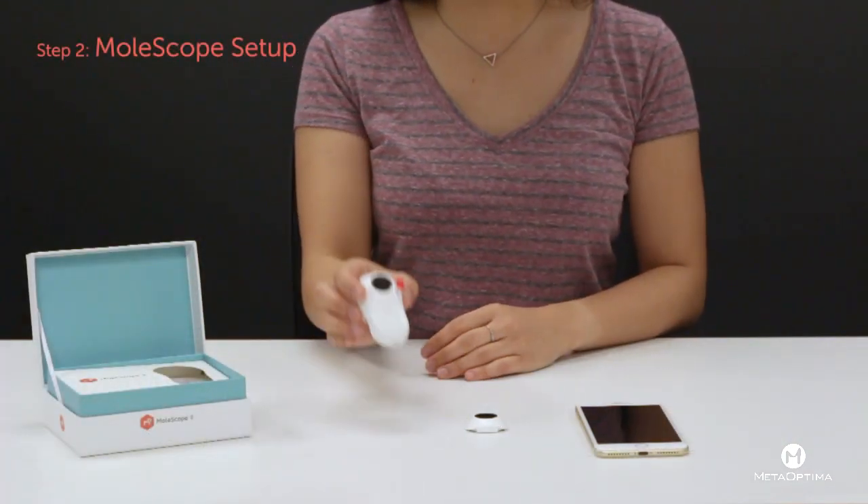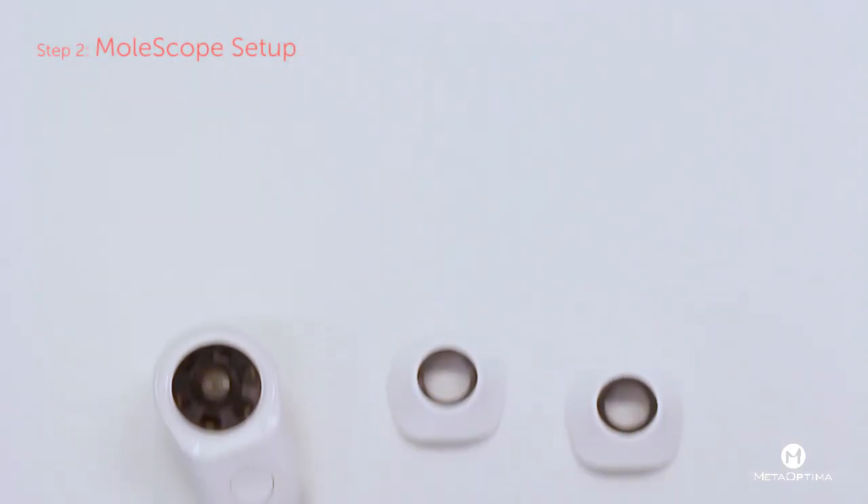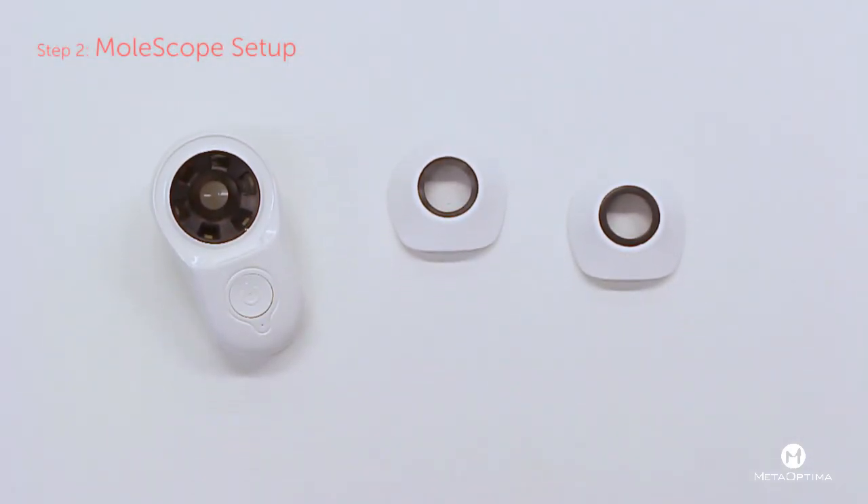Next, to set up your Molescope, pick an imaging cap most ideal to your needs. The contact cap has a glass plate that is directly placed on the skin, allowing for higher quality imaging and is recommended for most cases. The non-contact cap does not have the contact lens, which allows for imaging of lesions that are open wounds, certain raised moles, or other scenarios where contact imaging is not feasible.